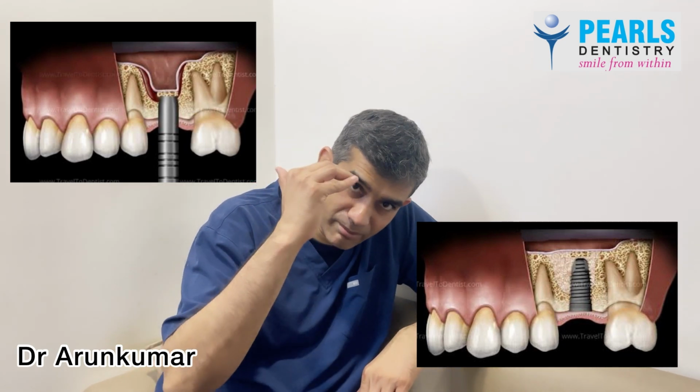There is a space that is created between the membrane and the underlying bone. In this space, we fill it with bone graft. So what is bone graft? Bone graft acts as a scaffold which helps our own body to form our own natural bone over a period of time. So when you lift the sinus membrane up, creating a space between the membrane and the underlying bone, and fill it with bone graft, then there is space for us to place an implant there.